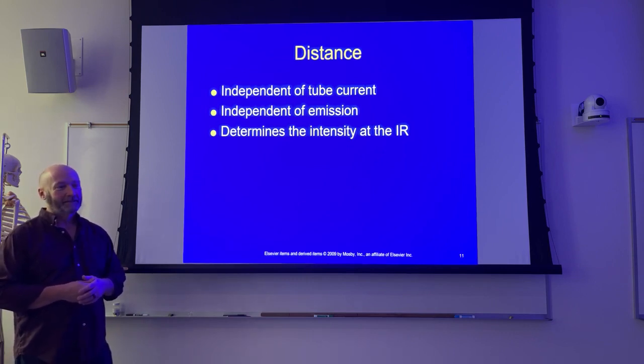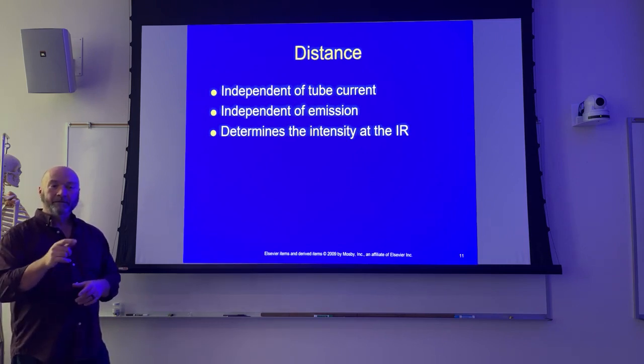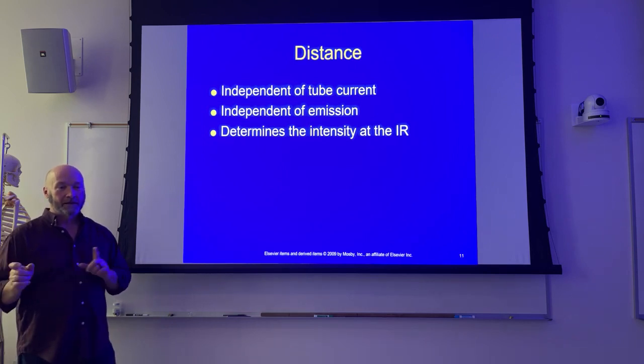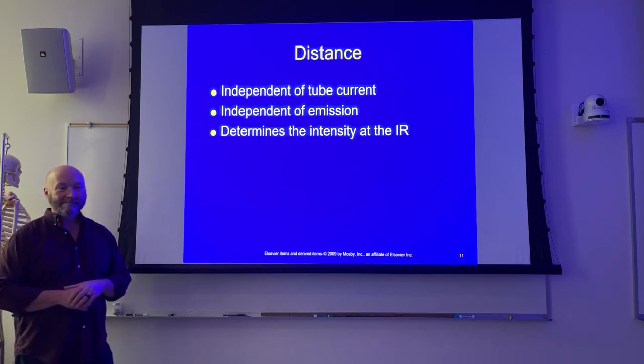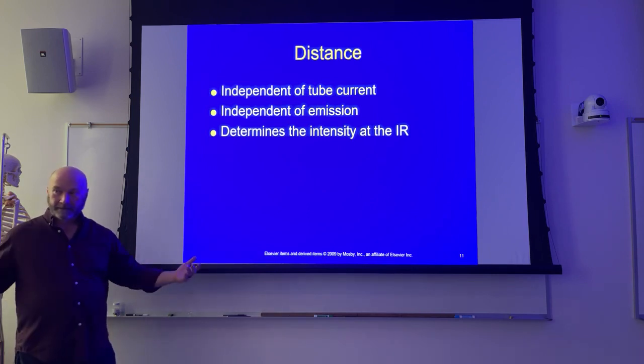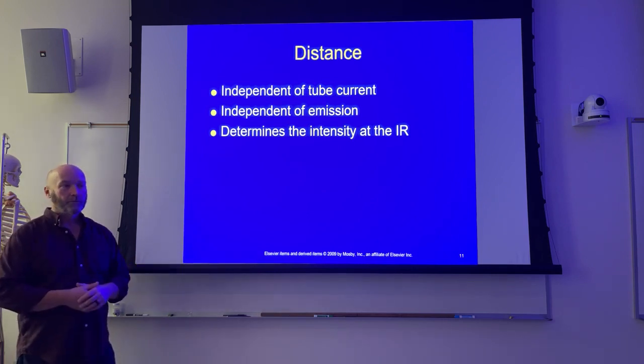Technique would be too low, but if you push the button that says AC joints, what all gets set for you? Everything, including radiation detectors, right? So you back up the patient to 72 inches, what's going to happen?